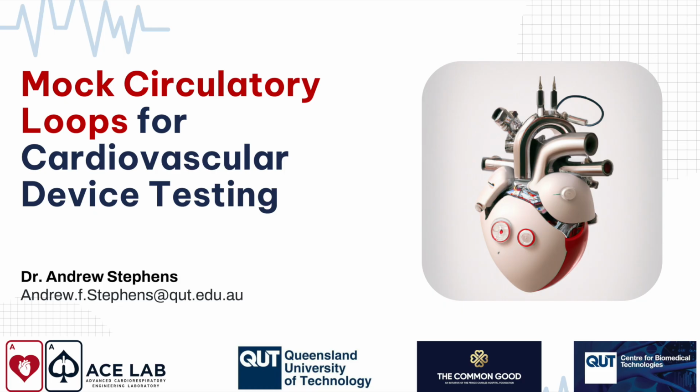In some mock loops, and in our mock loop, we actually used a chamber with trapped air, and that air actually acts like a spring. So when the water level rises because of the mock loop's fluid displacement, the air gets compressed and it becomes very springy, and then it wants to push back out, and then that pushes the fluid along, and also works to dampen the waveforms and absorb some of that energy.